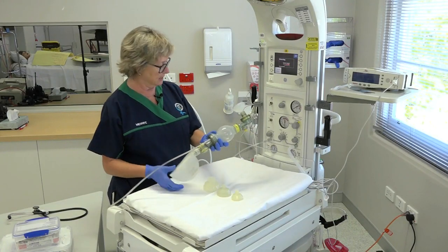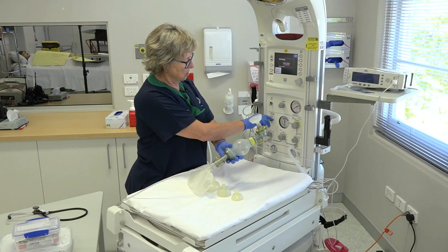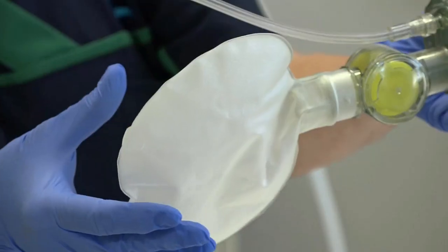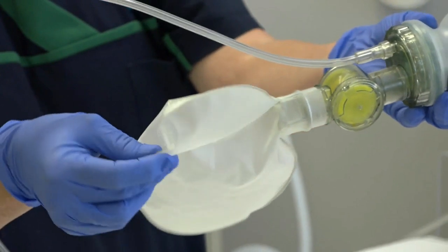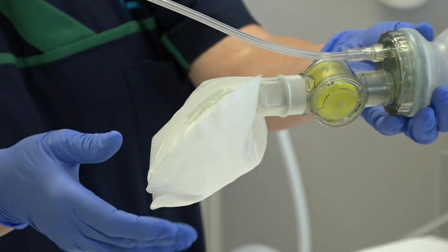Finally, to check that there are no leaks, we connect it to a gas source and turn that on at six liters per minute. You can see the reservoir — which is a 600 milliliter oxygen reservoir — is actually inflating, and that will indicate that there aren't any leaks.